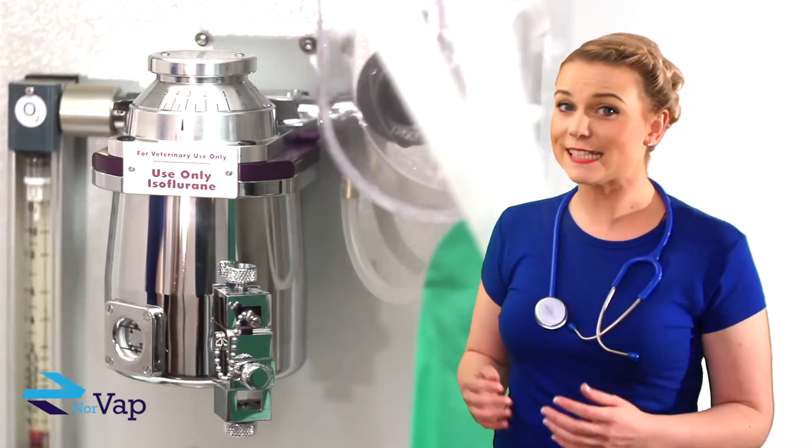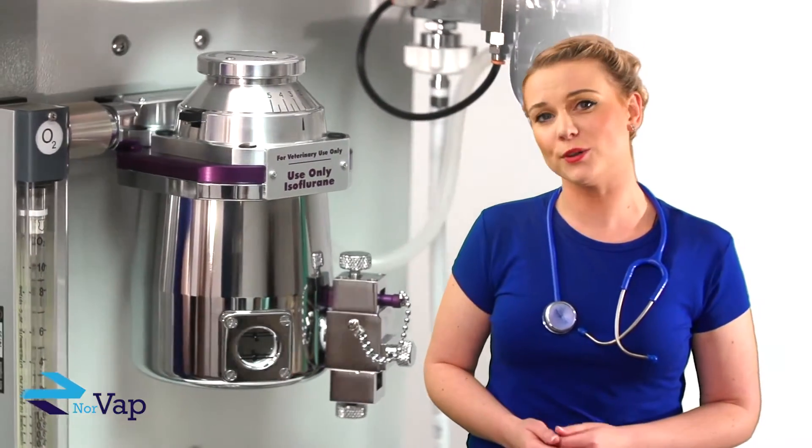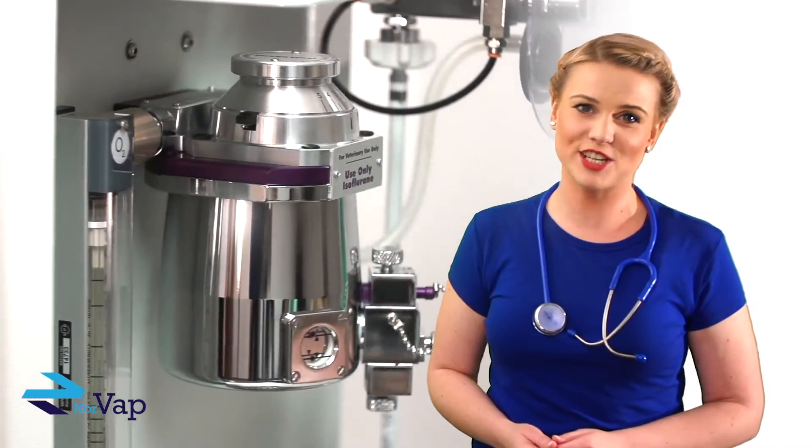The Orion 5 is made of lightweight aluminium, is anti-static, and is manufactured right here in the UK in our on-site CE certified machine shop.